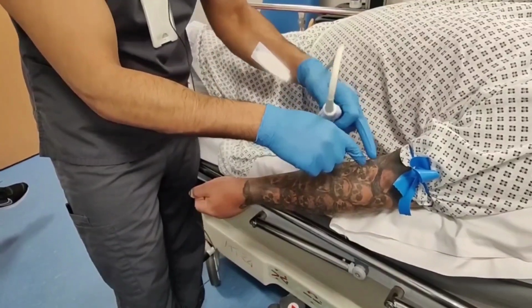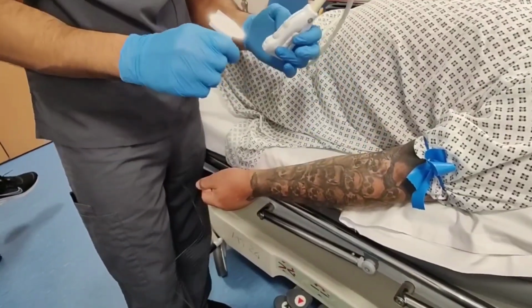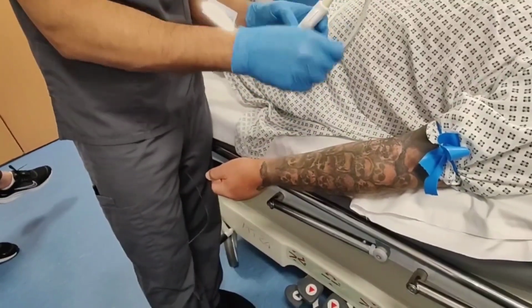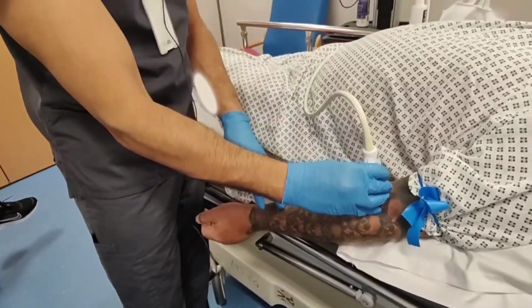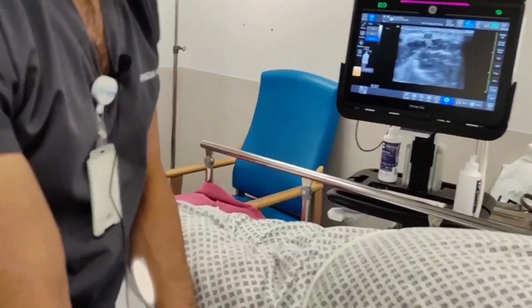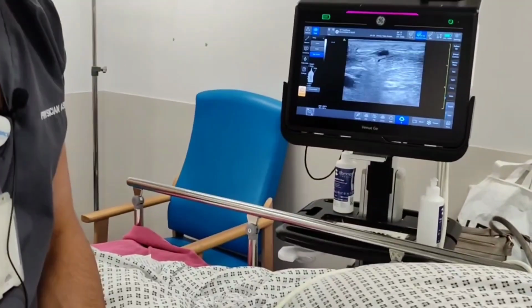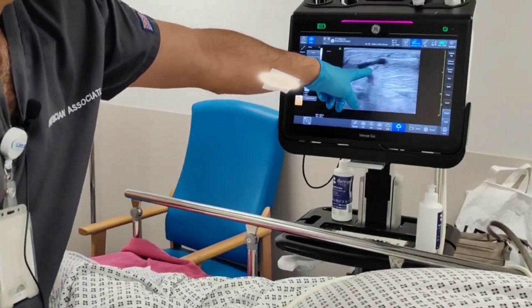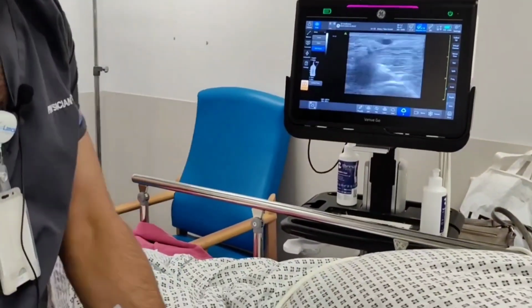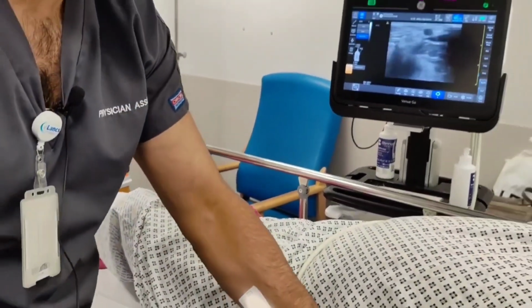Whereas at the peak, if I go from there, but then it goes deeper from the point of peak. So now if I go in with the cannula, I'm actually going to go in line and parallel to that blood vessel. So I'm going to have a much better chance of keeping the cannula in the vein. And that's precisely what I'm going to do here. So from here, I'm going to, from the more superficial point, I'm going to go from here, and that's going to be my point of entry about here. Just to point out, as I come further away, you can see there's a bifurcation here. Okay, there's a branch coming off the vein here. So that would not be a good point of entry. Okay, so to go in, I've got sterile gel on here, so I'm quite satisfied we've got a sterile field.